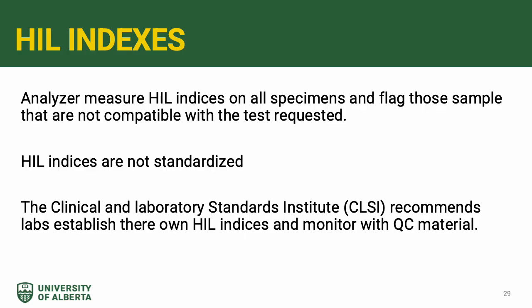Subsequently, the indices vary from instrument to instrument. In addition to the lack of standardization, manufacturers decide what level of interference is significant.